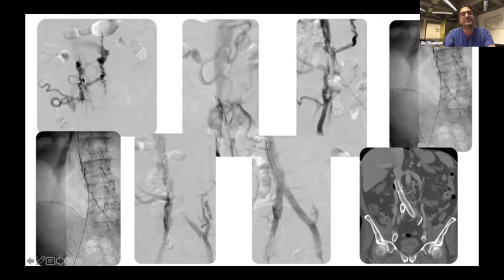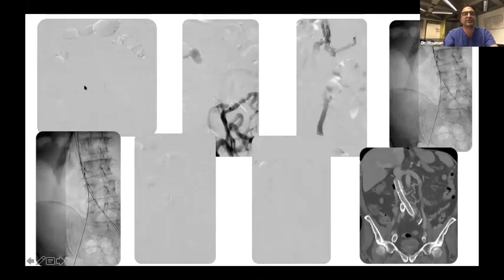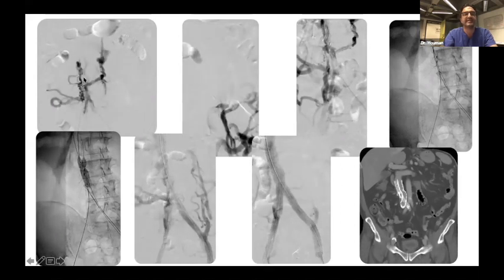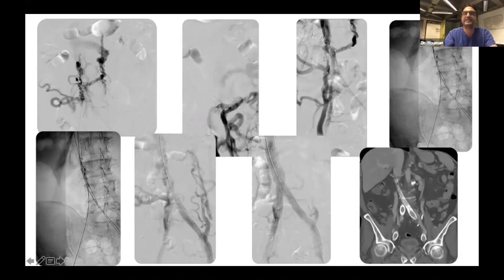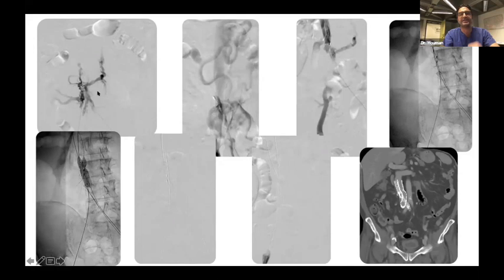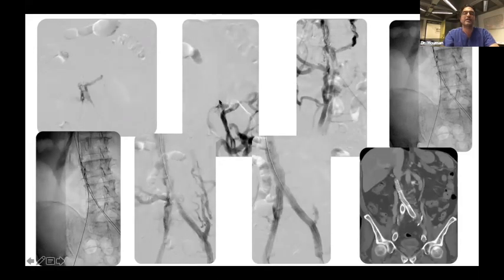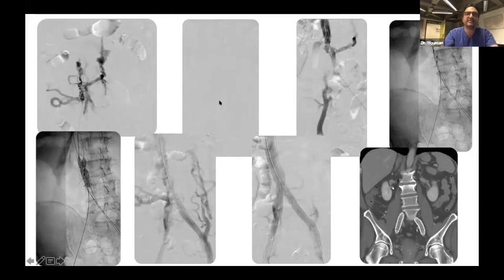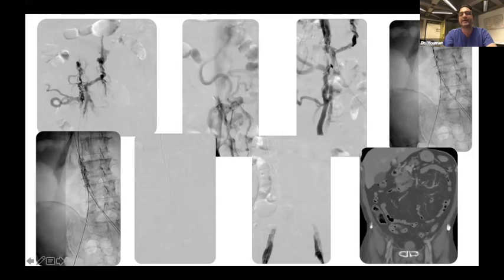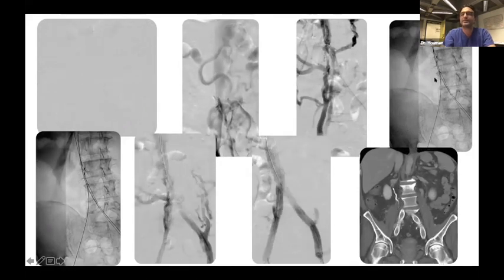A patient of mid-age with the chronic venous obstruction of the cava on both iliac sides, as you can see, and you see a filter in this area. The patient was dealing 3-4 years with this problem. You see the filter here and the occlusion of cava. We went antegrade bilateral. We had to puncture the right jugular vein, go retrograde. You see the wires from everywhere.